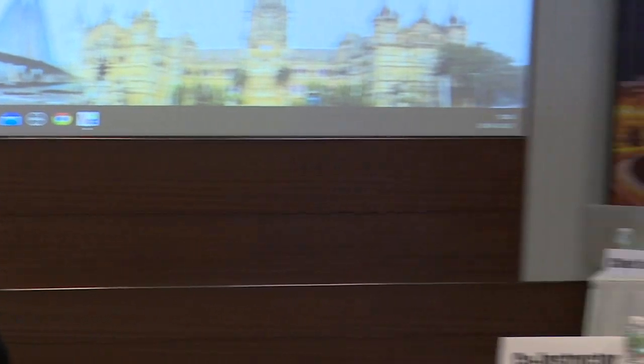Sir, I think what you just mentioned is very good for a pre-retinal hemorrhage. But just for the audience, I want to make it very clear, you should not go behind the blood and do a blind scraping in the submacular area. You can, not submacular, but it's not blind. You can actually see what you are doing. Okay. Because as I said, any trauma to the retina should be minimal.